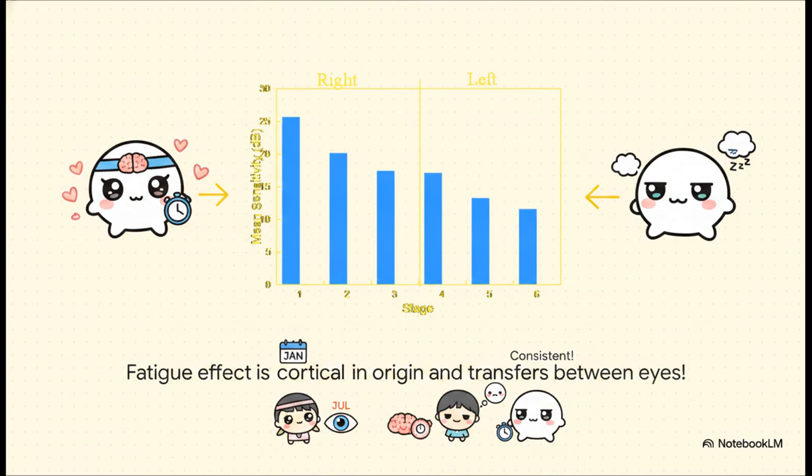This is undeniable proof of why you must keep the order of eyes examined constant between visits. Think about it. If you test the right eye first in January, you better test the right eye first at their follow-up in July. Otherwise, the fatigue effect is going to mimic disease progression in whichever eye goes second. Seriously, give your patients breaks.